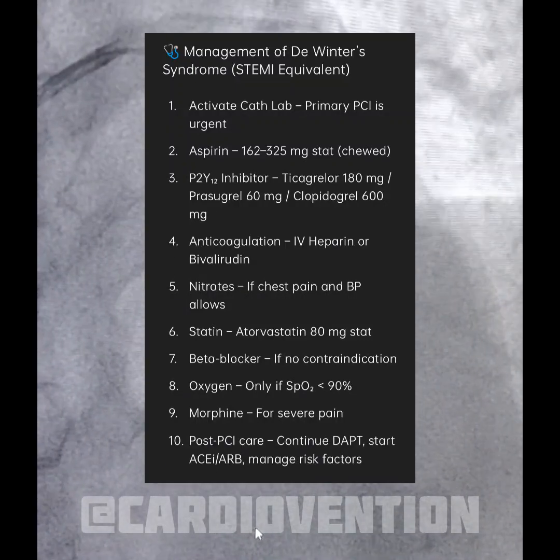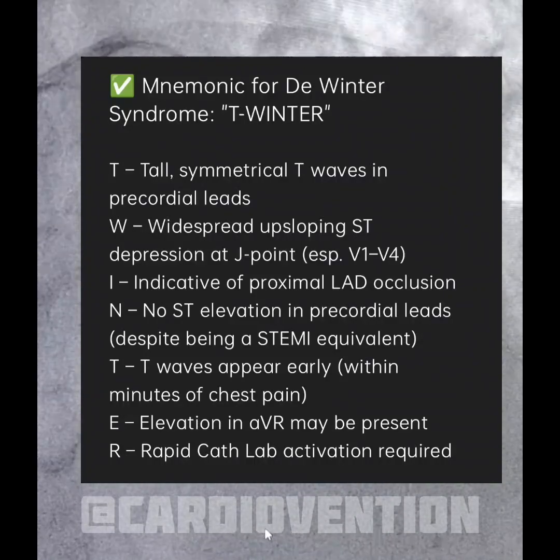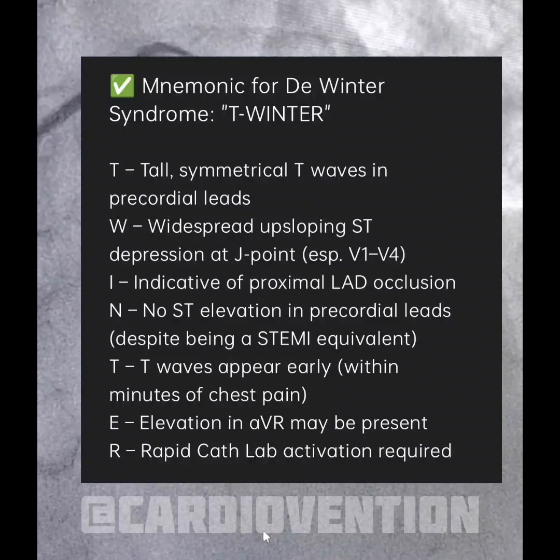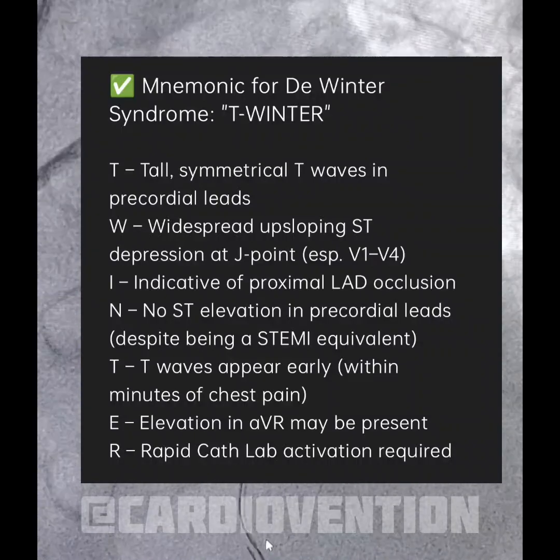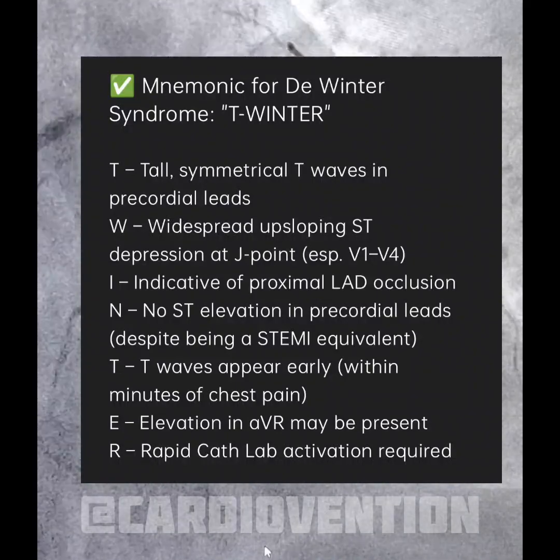Let's wrap up with a quick summary and mnemonic. De-Winter syndrome is a STEMI equivalent. ECG shows upsloping ST depression in the leads V1 to V6. There are tall symmetrical T waves, ST segment elevation in aVR, which indicates proximal LAD occlusion and requires urgent PCI.